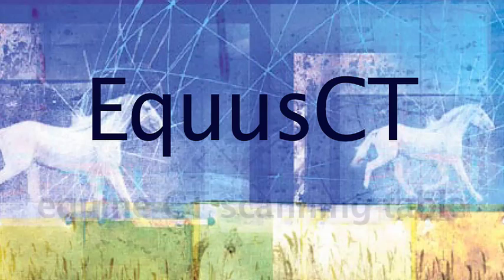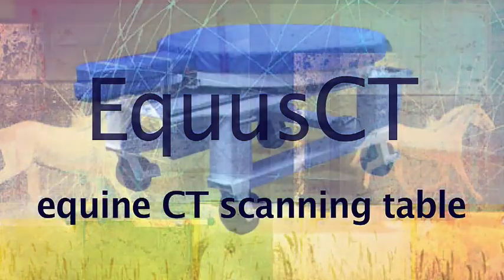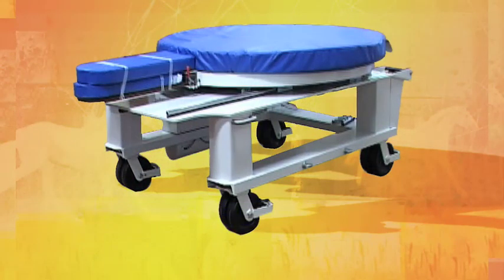The Equus CT. Ingenuity and patient positioning. Functional, adaptable, accurate. Solid construction, precise engineering, and necessity for equine CT scanning.